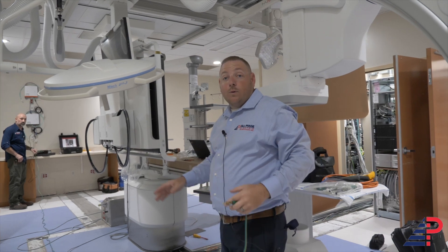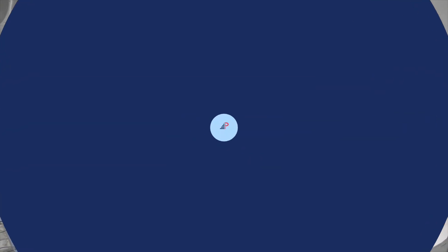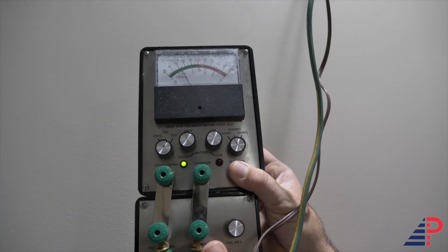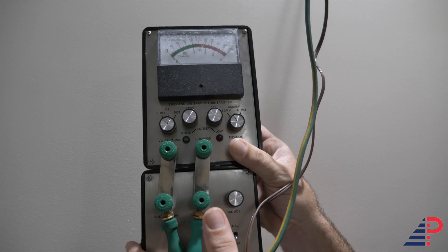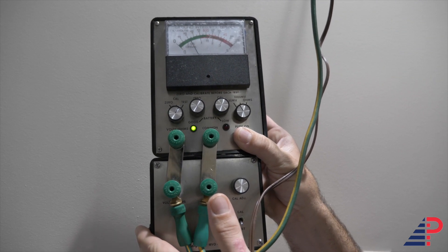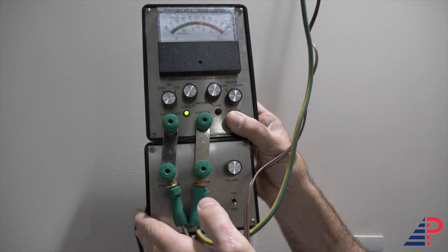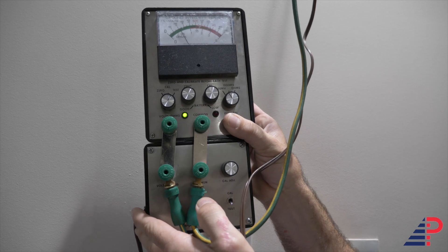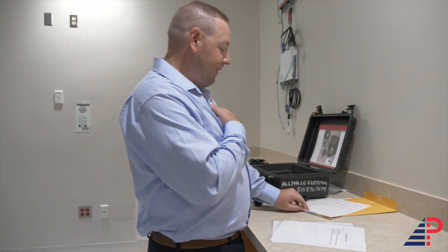From here, transfer over to a normal receptacle and do the same thing. The meter pings when you're not grounded. Once you're plugged into a good ground and you test on ohms, if the reading is under 0.1, that's a good test.